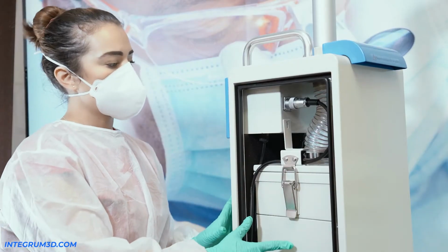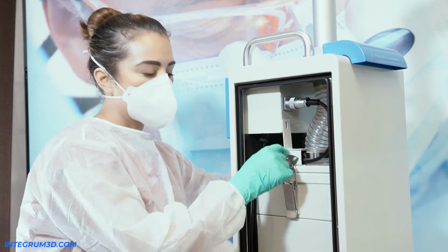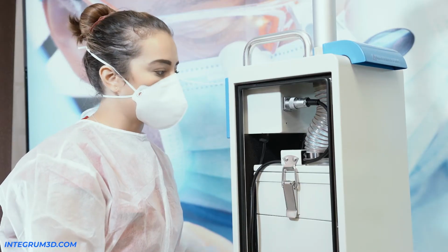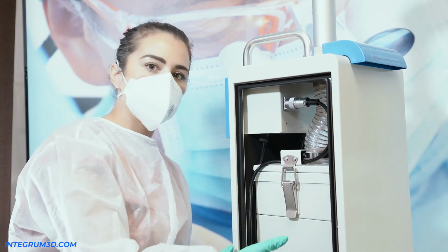When you first open your machine up to change your filters, you're going to see that there are 2 shipping brackets, one on each side. Go ahead and unscrew those. You can leave these off of your machine because they were only used as precautionaries during shipment. Now we can get to our filtration system much more efficiently.